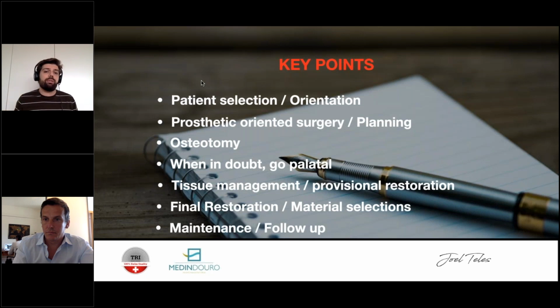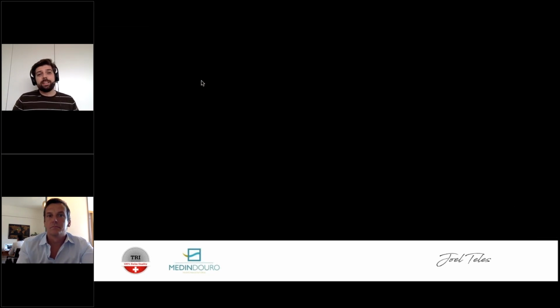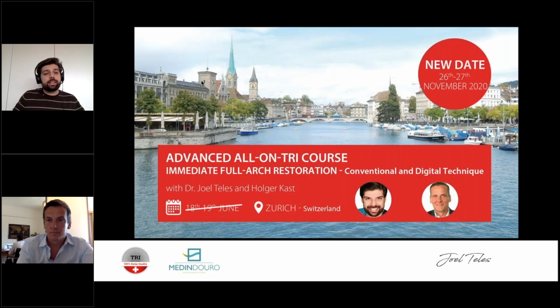And then maintenance and follow-up. Every 6 months, everything is unscrewed, cleaned, and shown to the patients. Those 2 pictures are important. Let them see what they're doing wrong. Seeing is powerful. And of course, check the torque, check whether the screws need to be replaced, check everything. This is a plan for life. The patients will stick with you for the rest of their lives. Okay? And so that's it.